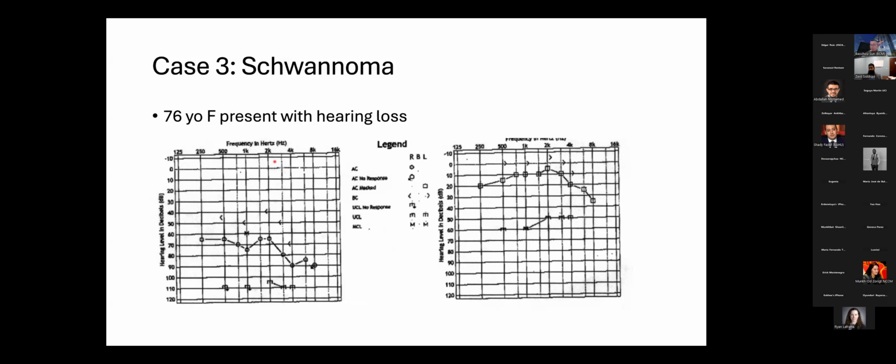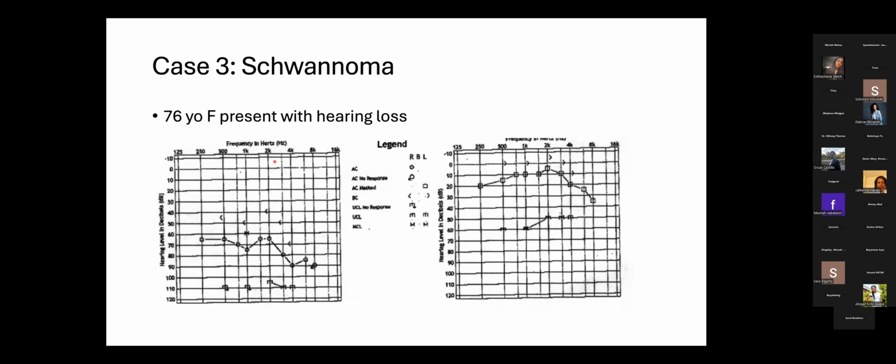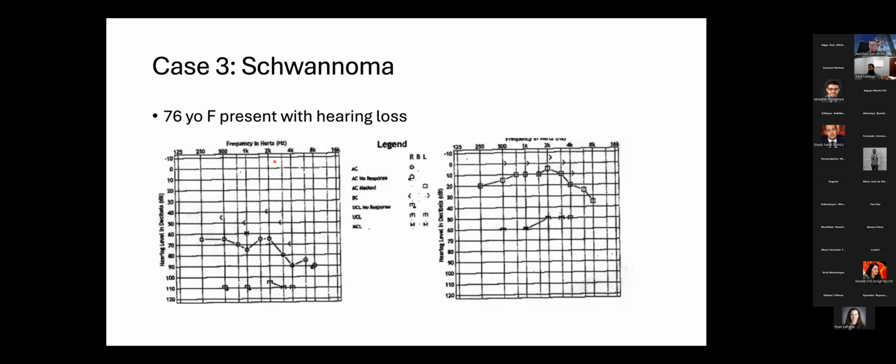The other reason is that vestibular schwannoma is a baseline case for many other skull-based lesions like meningioma and pituitary adenoma, which are also very common and can be treated with radiosurgery techniques with similar dose and similar constraint considerations. So this is a patient I treated recently. They usually present with unilateral hearing loss. So this is an audiogram showing that the right ear has a significant decrease in hearing compared to the left ear. You can see the decibels required to hear the pure tones in the 60 to 90 range.